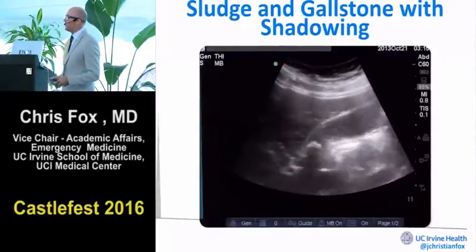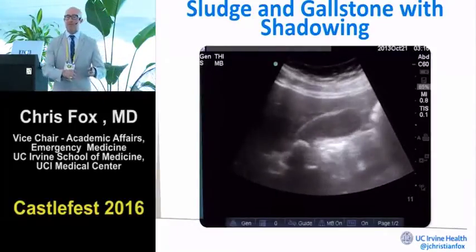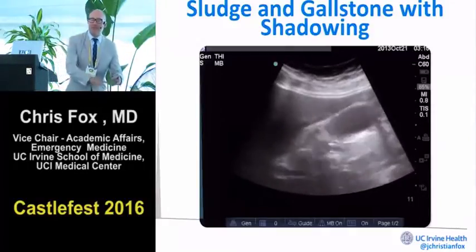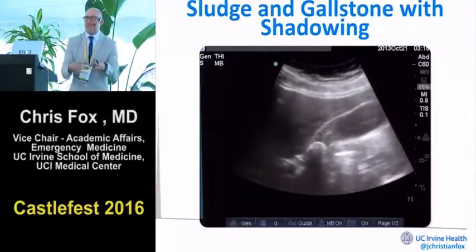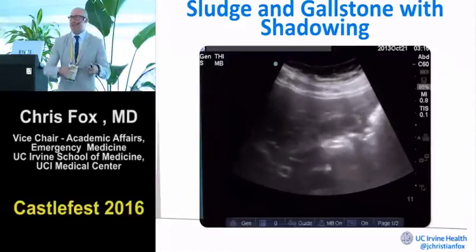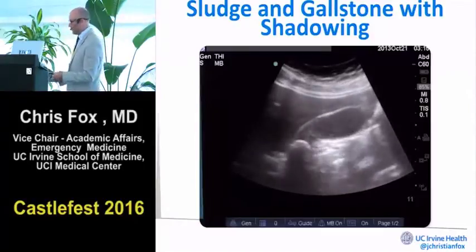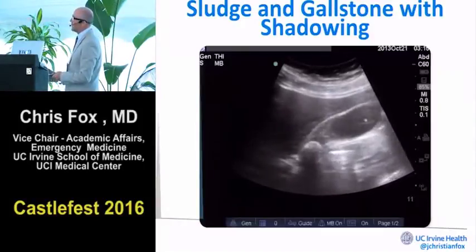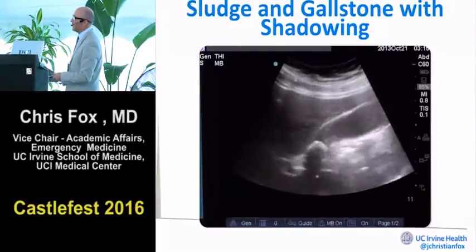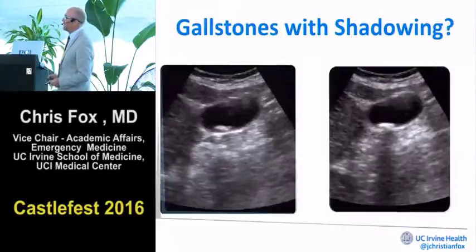Now, the problem, though, is this whole spectrum with the chylomicrons, right? They're like crashing out of solution, and their tails are lining up, and then, I'm just making this up, actually, they sort of get more viscous, and they start crashing out of solution, and they get sludgy, and then that sludge starts to coalesce, and you get stones. But before the stones, you usually get the sludge, and so that's what we're looking at here. Sometimes it's even hard to see the gallbladder when it's filled with sludge. Here's the stone down here in the neck. That's the stone in the neck of the gallbladder with the sludge around it there. Luckily, we were able to see that one.